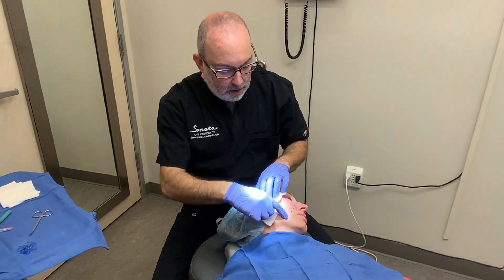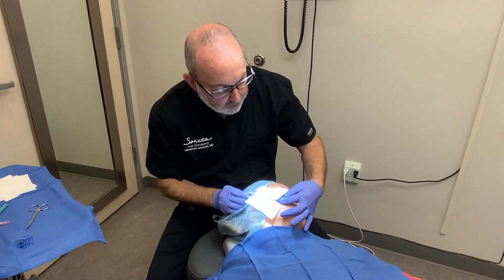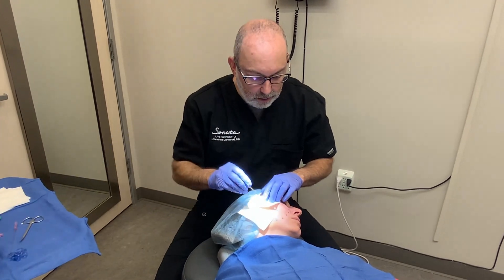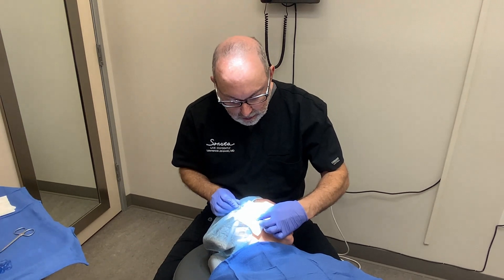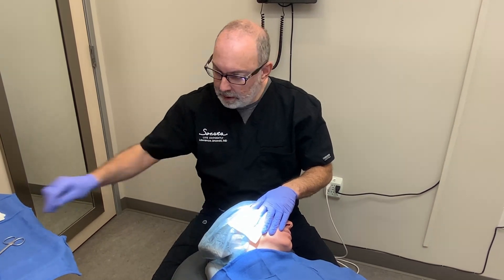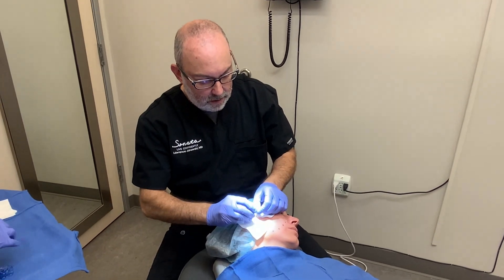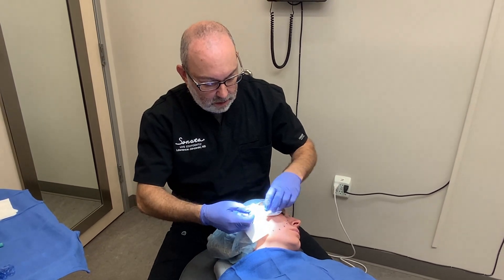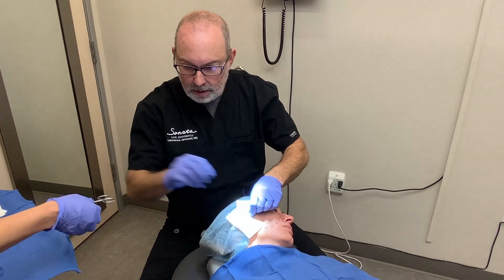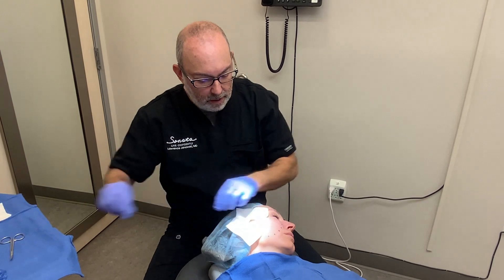Our second set is going to skip the two that we just did, and we're going to go to this point here, and then the one below that is at the marionette area, staying subcutaneous and not catching any skin there. We can tie these two, then cut and bury the knot. Pushing down, we'll pop the knot under the skin.